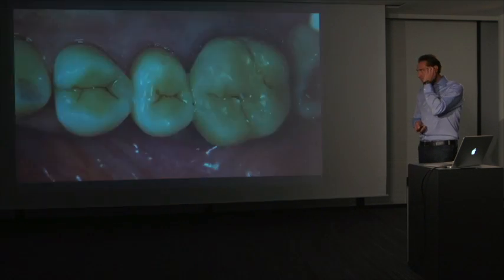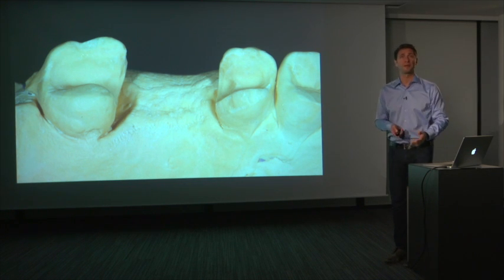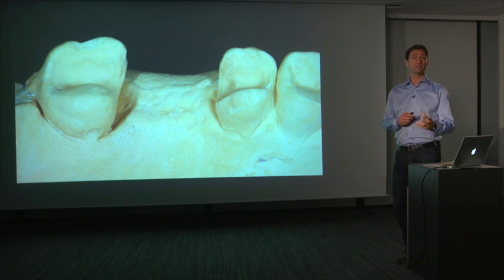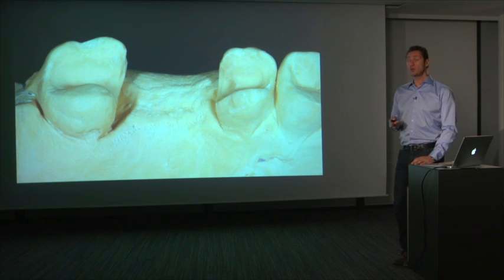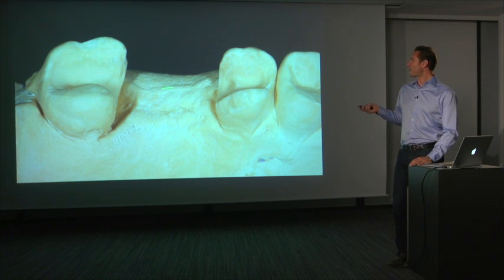When we want to take it a step further and maybe offer some options for patients, maybe compromised situations, and we want to preserve as much tooth tissue as possible. Here it was a perio patient, and we want to combine maximum tooth preservation with some predictability and not too high costs. Well, this could be the wonderful solution of doing it indirect, of course, and using the inlay parts as support for the pontic in between.